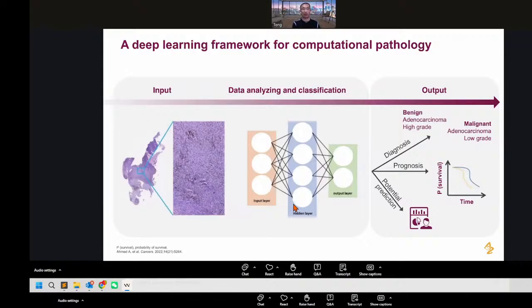To put it in a simple way, the machine reads the slides and converts them to digital form, and from the input layer it takes the features. The computer reads the slides as features, such as intensity, like a vector. They are then translated into the hidden layers for different processes, depending on the model. That is the overall flow.